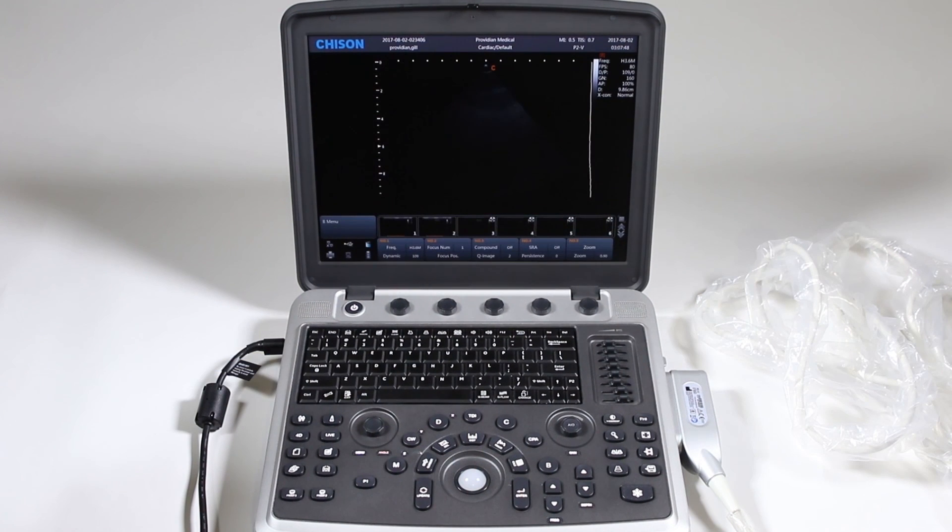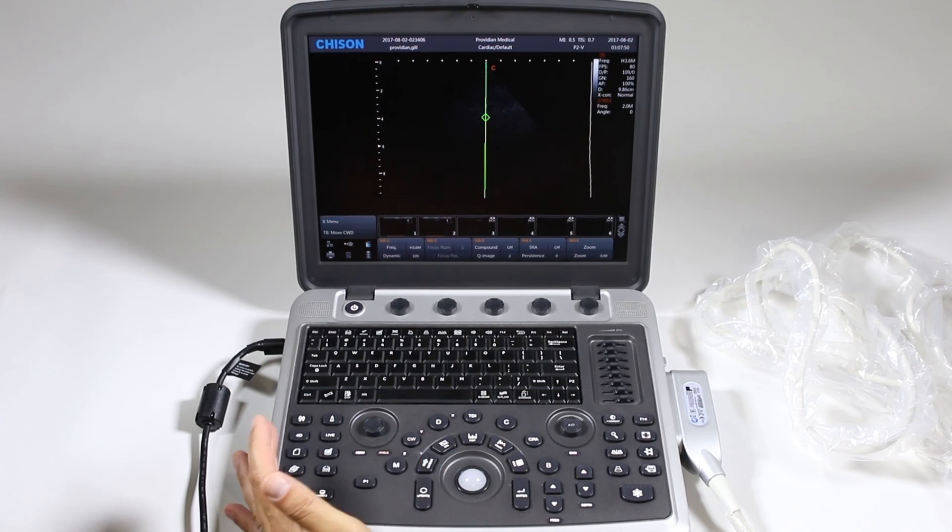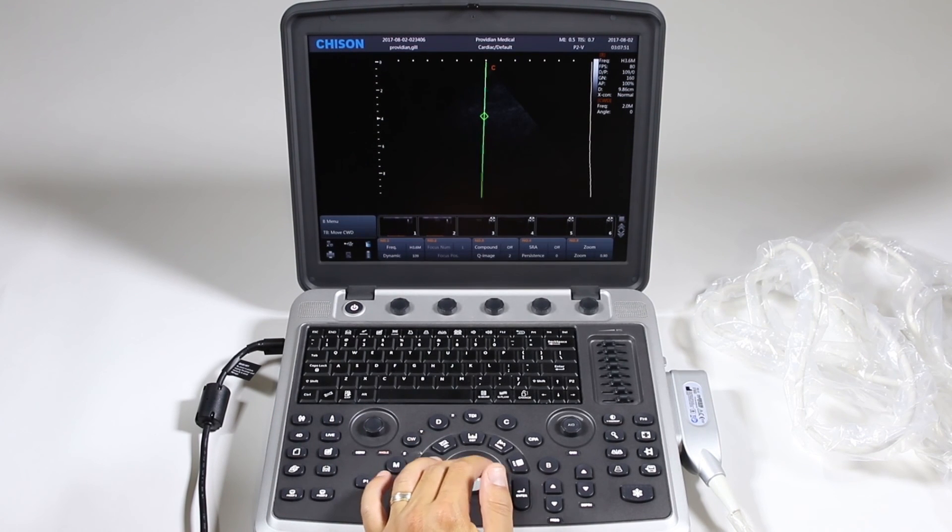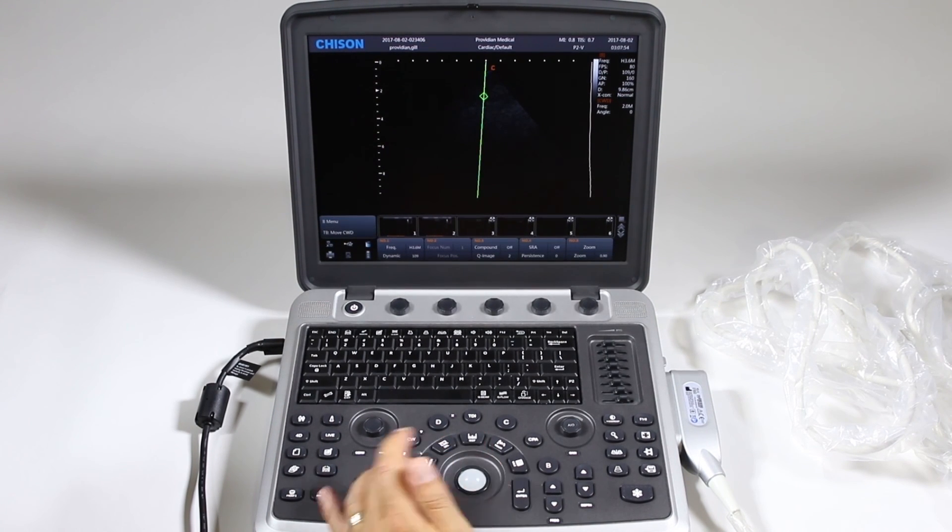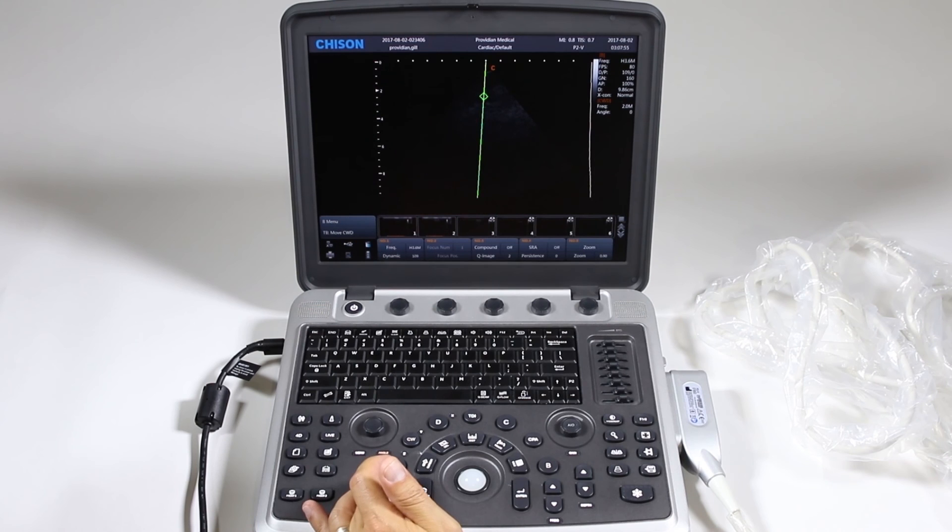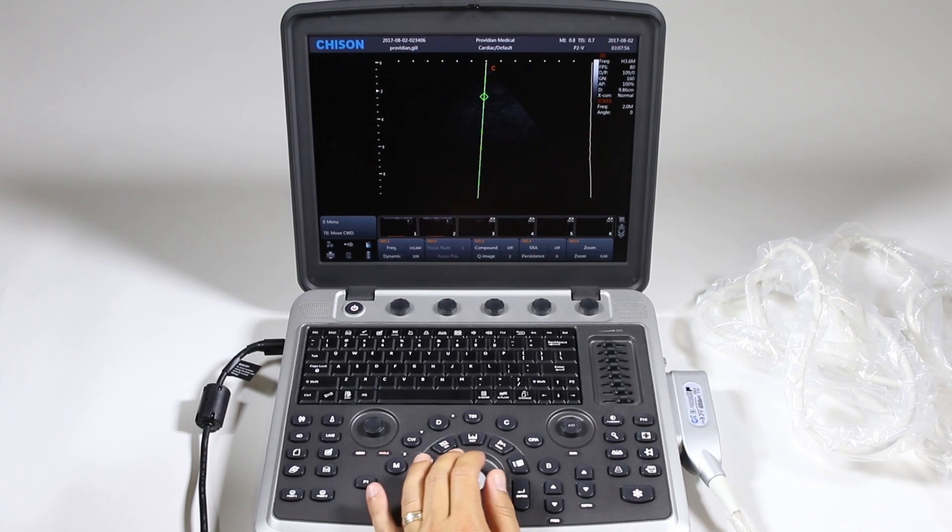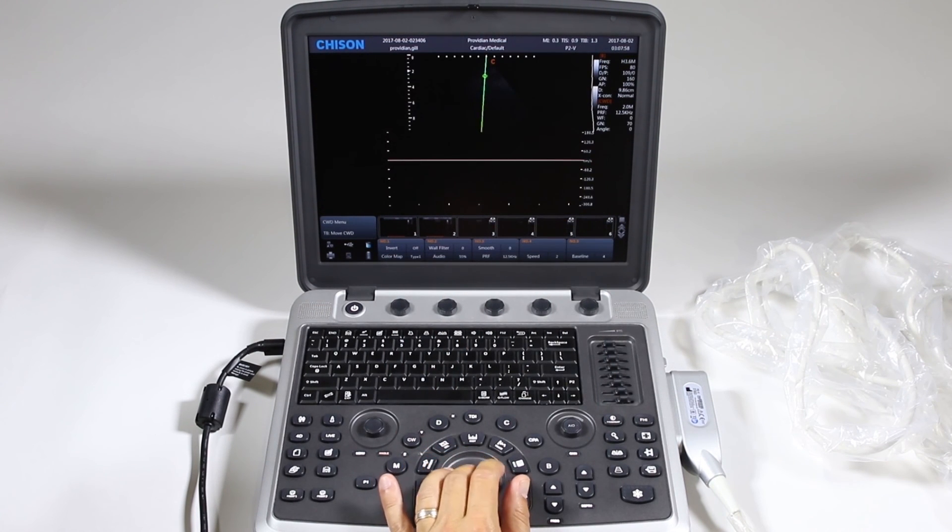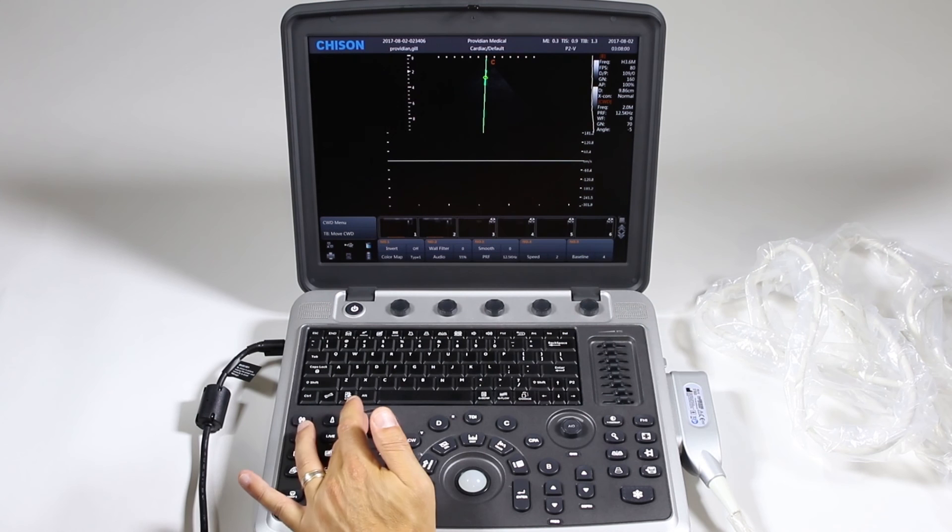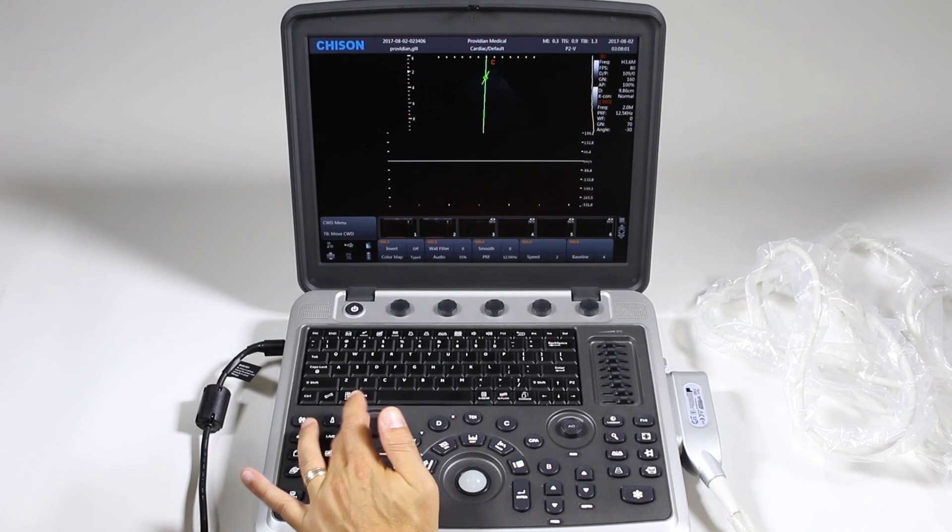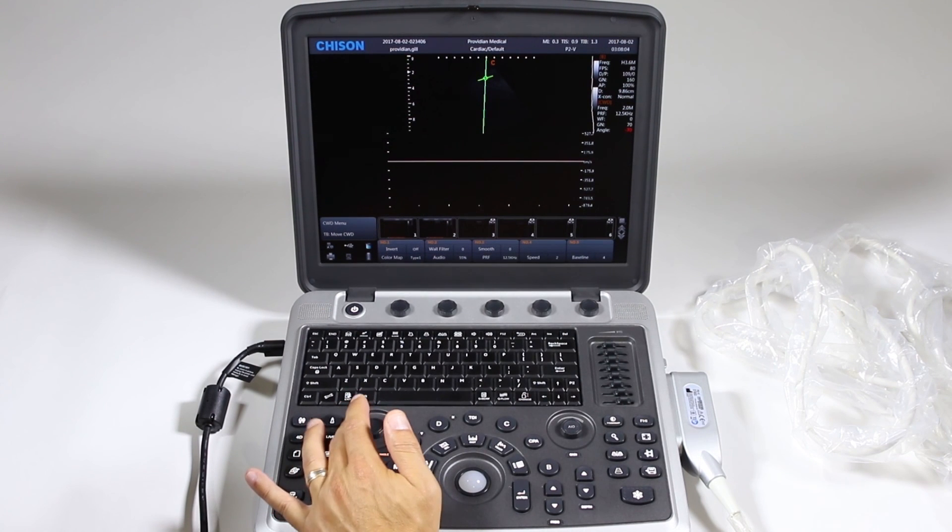Now for CW continuous wave Doppler, just push it down just like pulse wave Doppler. Choose your area of interest with your gate. Hit update.